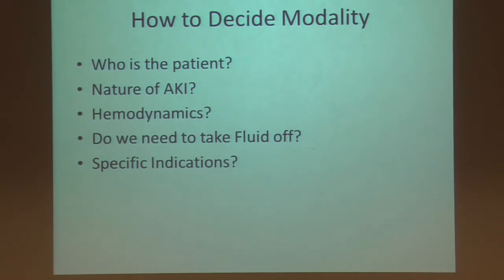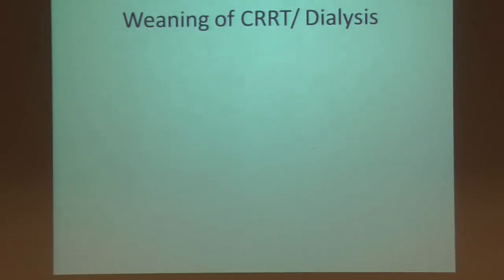So again, how you decide: who's the patient, what kind of kidney injury is it, what are the hemodynamics, how much fluid you take off, and are there any specific indications for either type of therapy? So that's that.